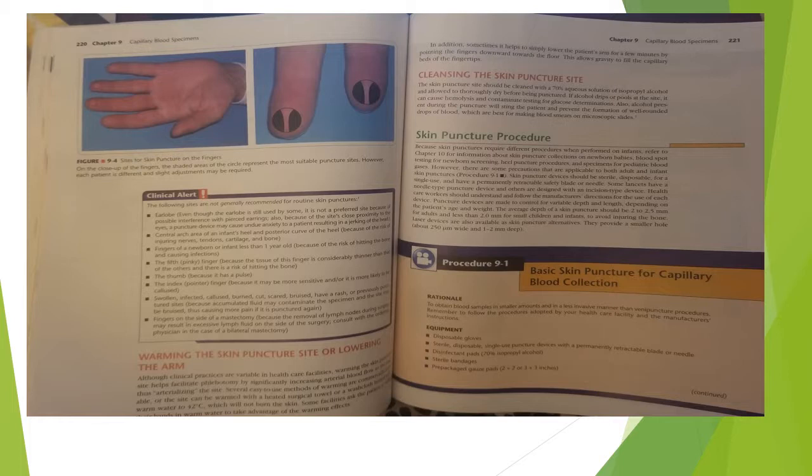Skin puncture procedure. Because skin punctures require different procedures when performed on infants, refer to Chapter 10 for information about skin puncture collections on newborn babies, blood spot testing for newborn screenings, heel puncture procedures, and specimens for pediatric blood gases. However, there are some precautions that are applicable to both adult and infant skin punctures.